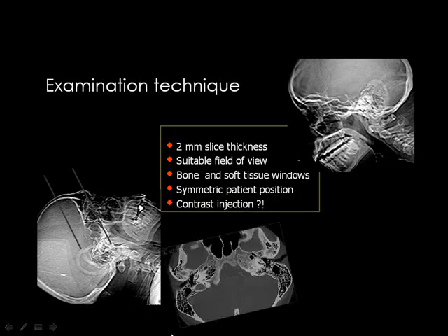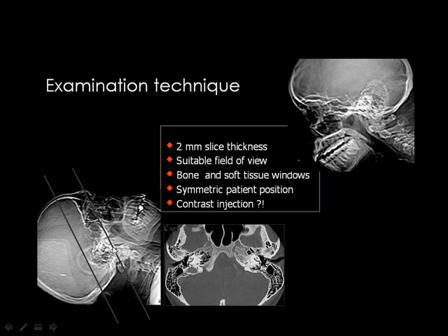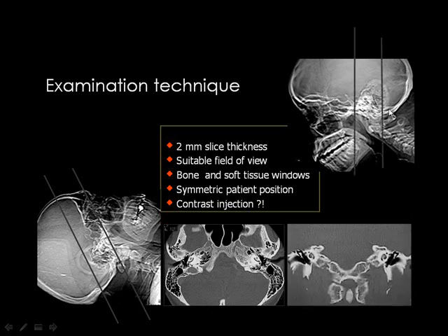And then we identify the area to be examined for the CT, starting from the skull base, proceeding superiorly until we reach the apex of the Petrous bone. And this is an example of the axial image while the patient is facing up. Then in the prone position, we start from posterior, then proceed until we reach the anterior aspect of the Petrous bone. And this is an example for the coronal images.